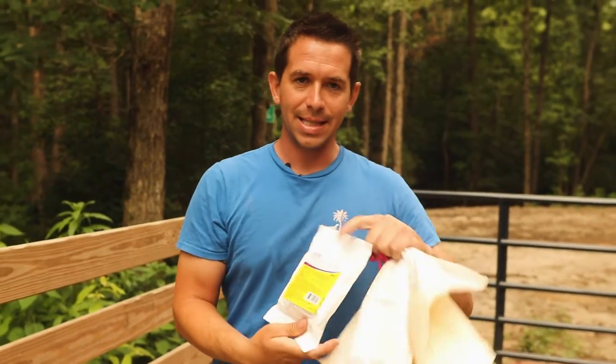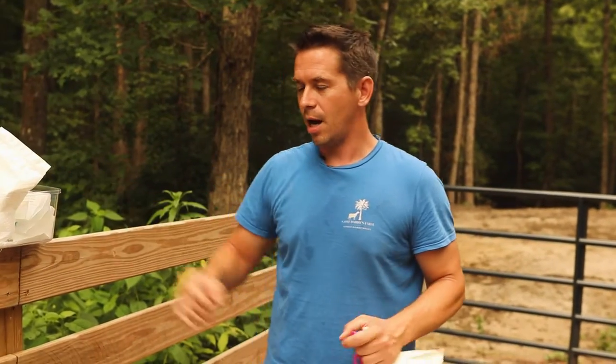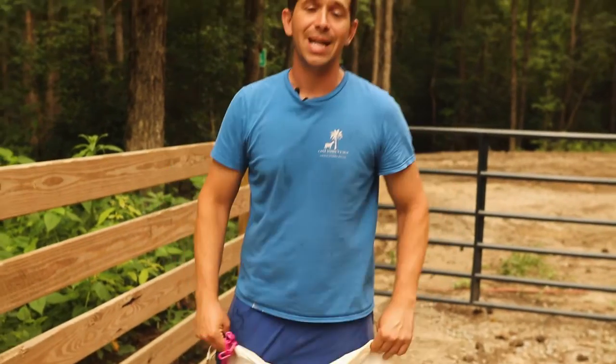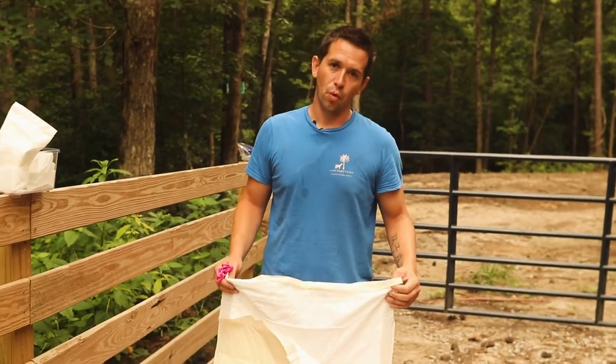C-I-D-R is the acronym, and that's these things right here. It's called an easy breeder. We get these things from valuevet.com. We use these with the help of our veterinarian. So what we're going to do is set up and go step by step today over how you would use these on your goat herd and what they are used for.